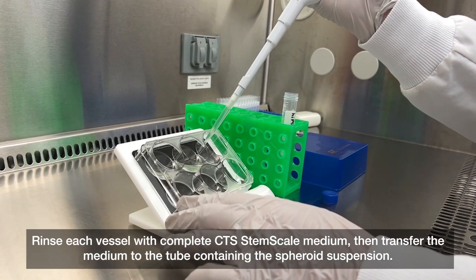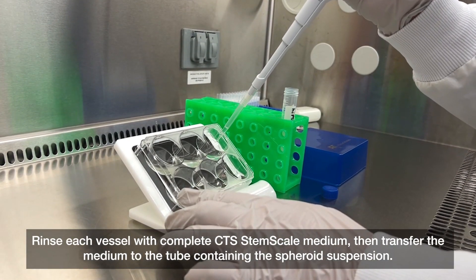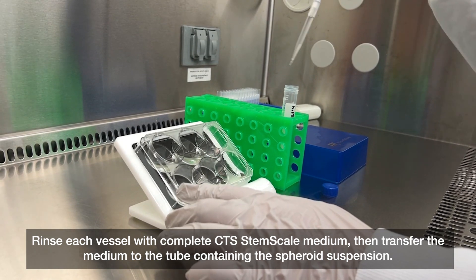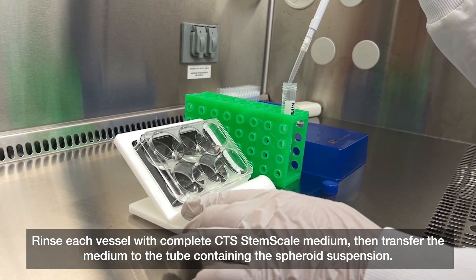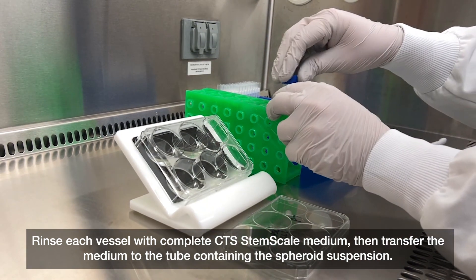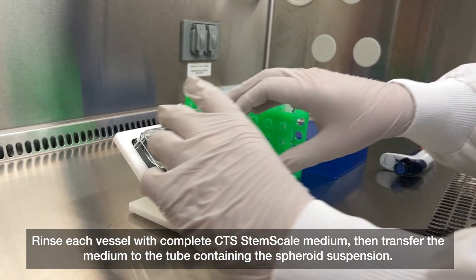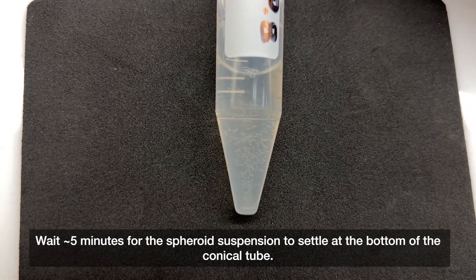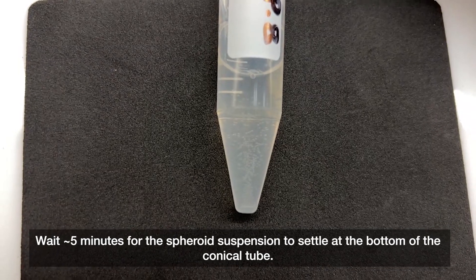Rinse each vessel with complete CTS StemScale medium, then transfer the medium to the tube containing the spheroid suspension. Wait about five minutes for the spheroid suspension to settle at the bottom of the conical tube.